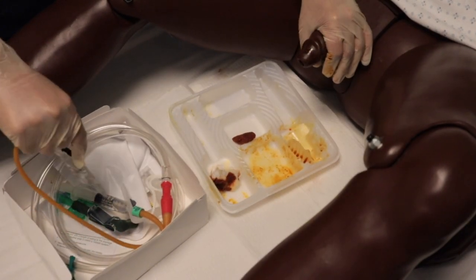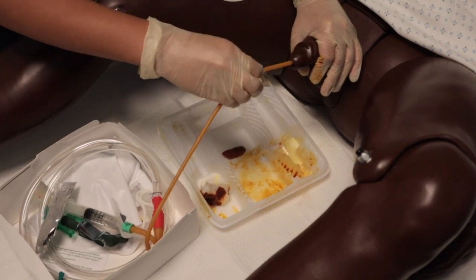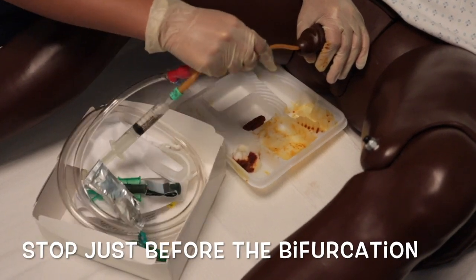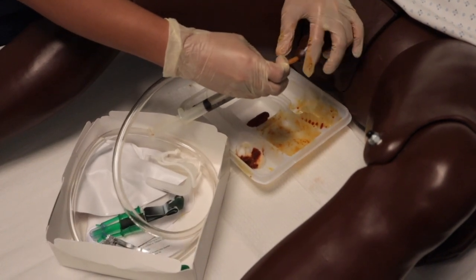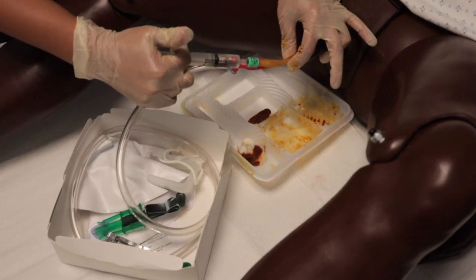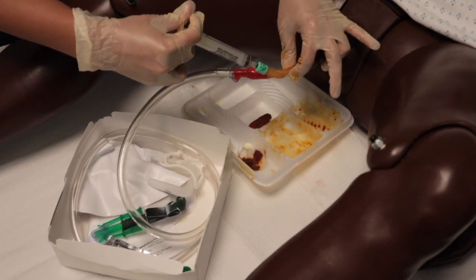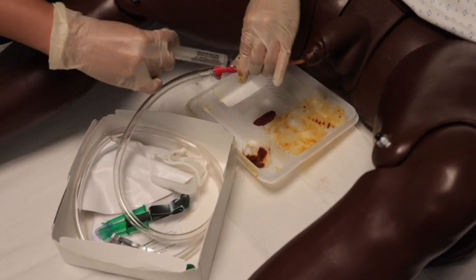Grab the catheter, insert, then advance. Because the bladder is farther away from the urethra opening with males, I will insert all the way up to the bifurcation, or splitting of the catheter. Grab the outside rubber part to stabilize. Inflate the balloon. A little tug, then disconnect the syringe.